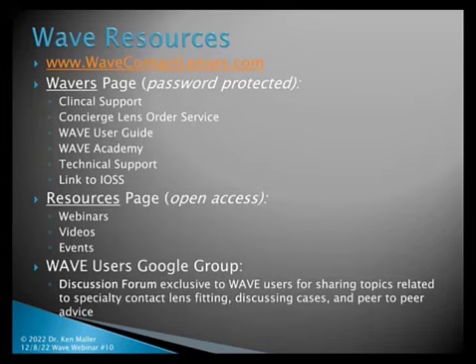So I can tell you from experience, it's certainly possible to get a patient successful without profilometry. However, it is much faster and more efficient, and you will also ultimately achieve a much better design, both from a comfort, wearability, vision, and physiology standpoint than you're able to do from troubleshooting from the slit lamp. So at this stage where this technology is available, I couldn't even imagine going back and trying to design lenses without the profilometry. It will totally change the way you design lenses.